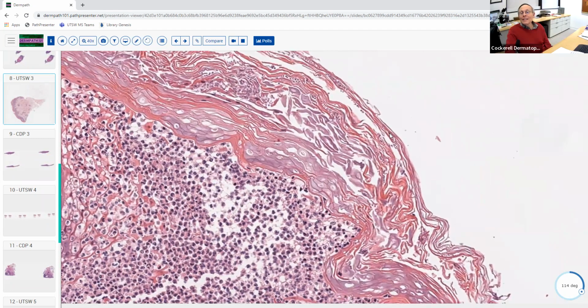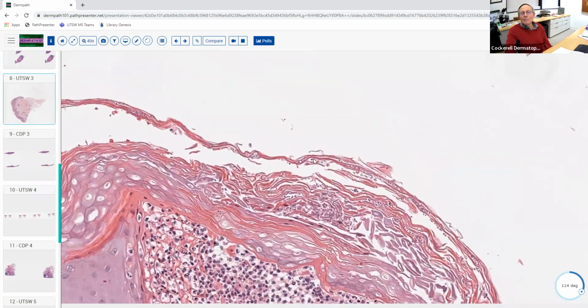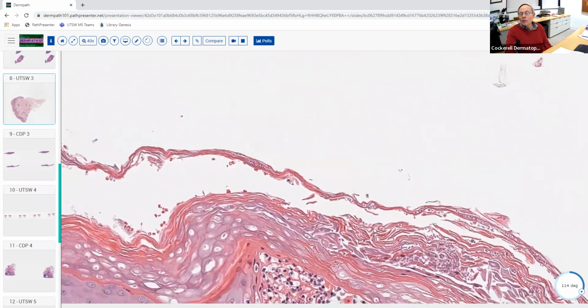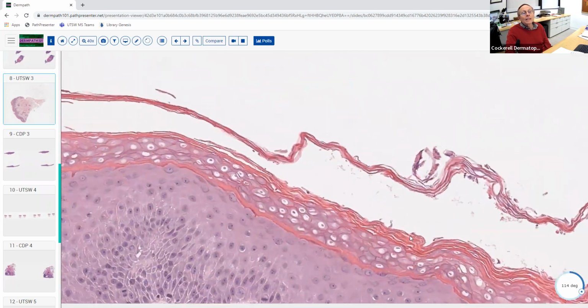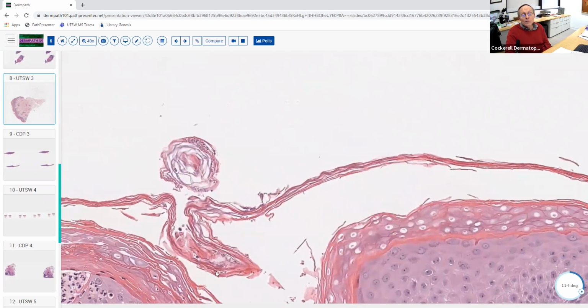Can you see these things here that I'm pointing out? Yeah, are those like little spores? Yeah, there's like a gazillion of them. Oh, okay. And notice where they're living. They really like to live in this interface between the normal stratum corneum and then the abnormal parakeratotic areas here where there's some crust, the so-called sandwich sign. So that's where fungi like to live. And probably you can even see some over here too, right in this area.